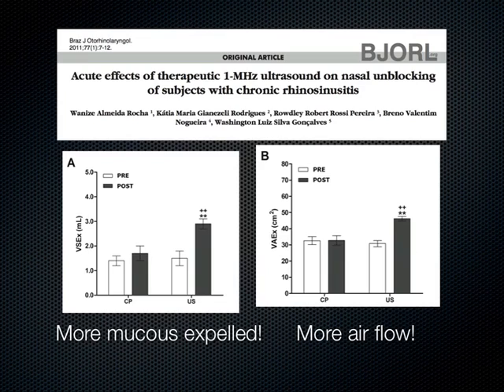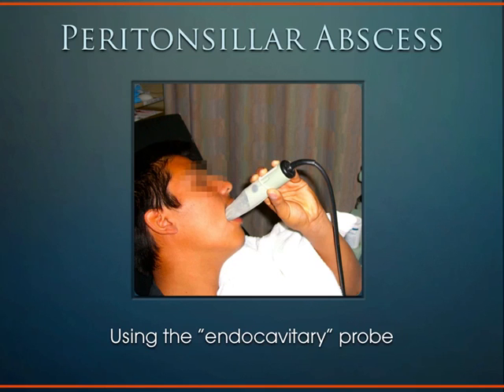A lot of this stuff requires, obviously, more research, but this is something that I found sort of intriguing when I first found out about this, that you can actually use ultrasound not just diagnostically with the sinus, but therapeutically as well. Switching gears, and we're going to talk now about peritonsillar abscess.